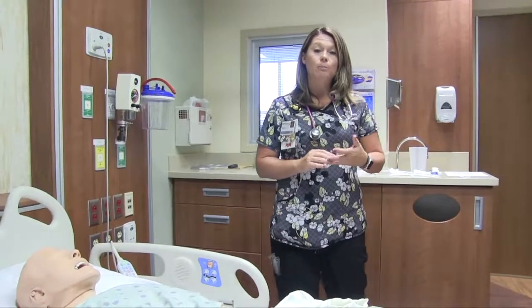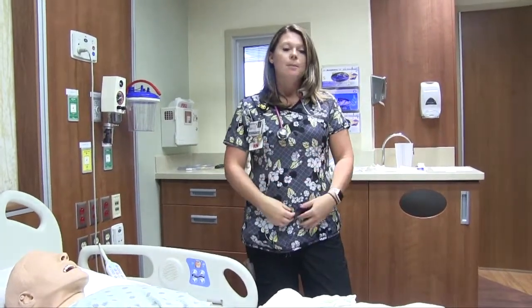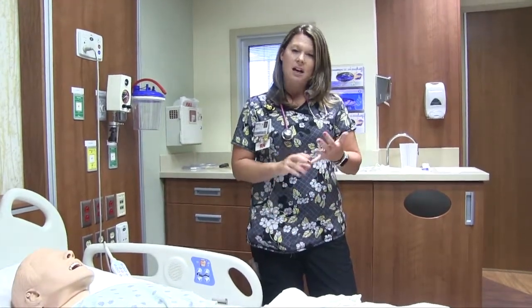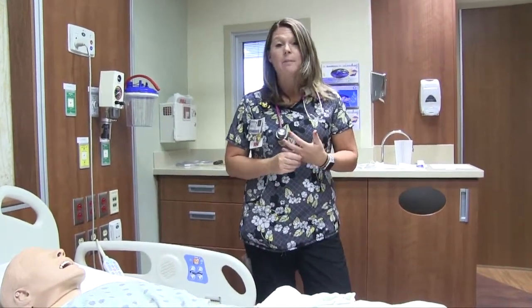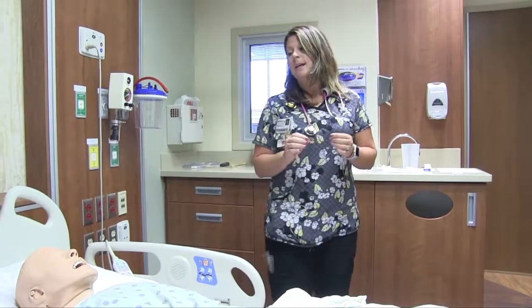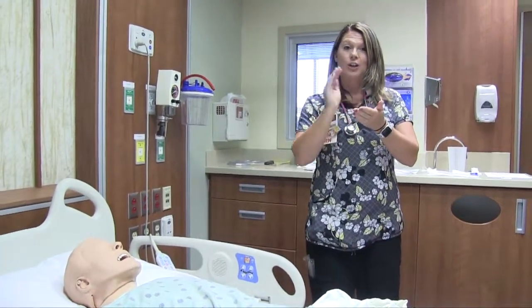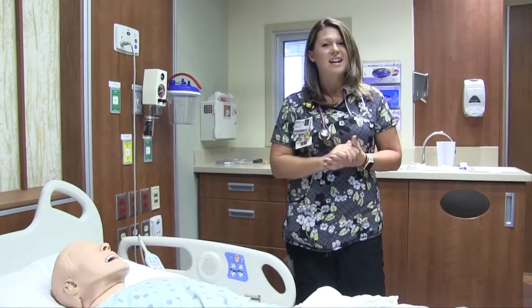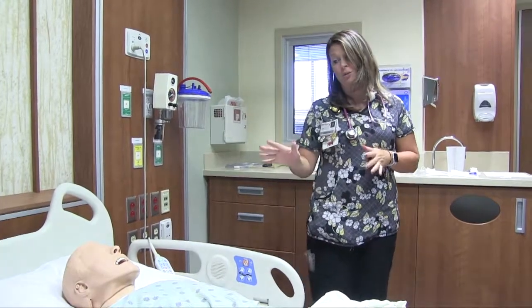There are things that are called bladder spasms. Some patients experience them, some people do not. But if you get some tightness down in your lower abdomen that's not relieved by Tylenol, you need to call your doctor and they can prescribe you a medication that can help with those spasms. When you do have spasms, a lot of people do experience a little bit of leakage of urine around the catheter area. That is one of the telltale signs of a bladder spasm. So call your doctor and they can prescribe you some medication for that, because there's no reason to be uncomfortable with this.